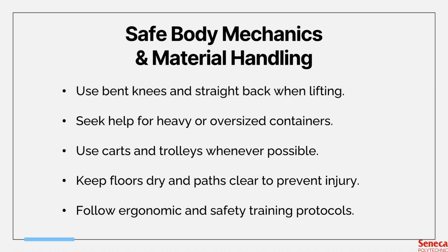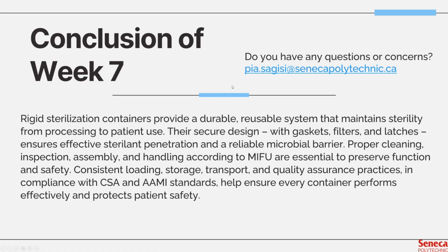All right, so these safety habits protect you from injury and also prevent accidental dropping or contamination of sterile items. And that's the end of the slides for today. So just remember, rigid sterilization containers provide a durable, reusable sterile barrier system that maintains sterility from processing all the way to patient use.